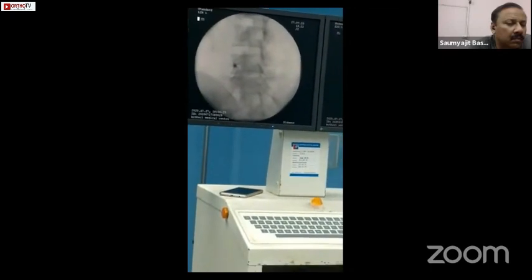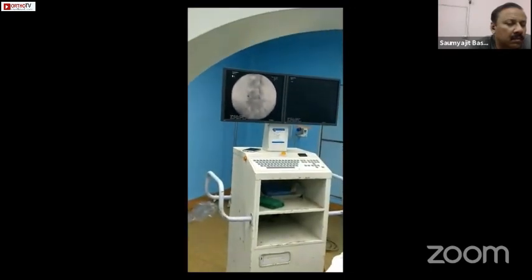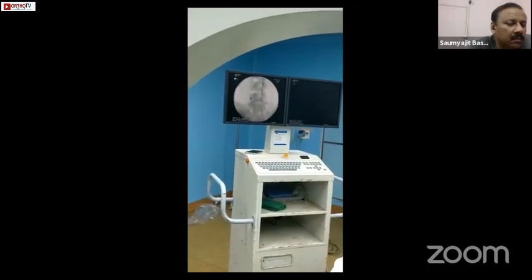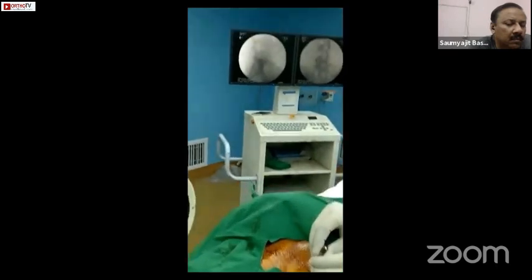So as you can see, we got a provocative response. And I'm going to take a lateral shot to show you the exact position. Now you can see that I'm adjusting the amount which I need to go in.